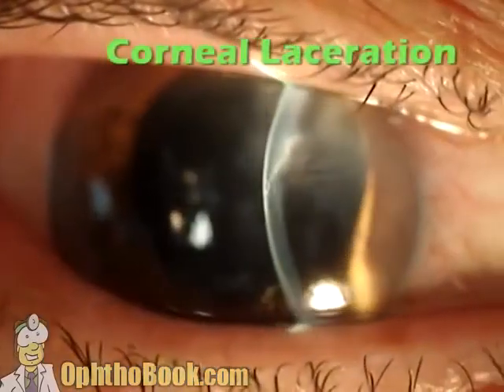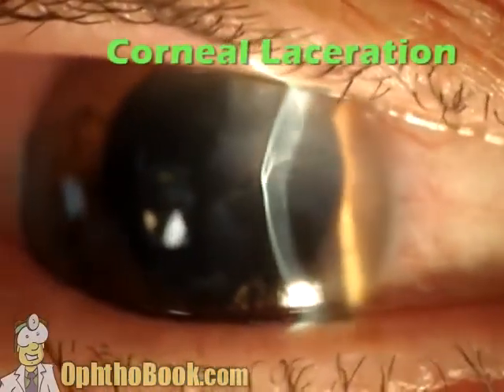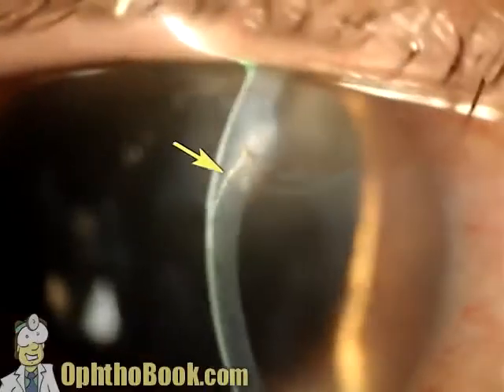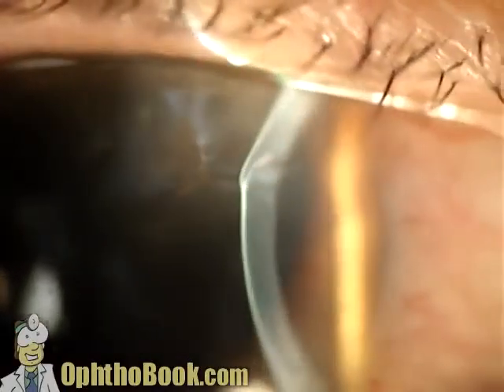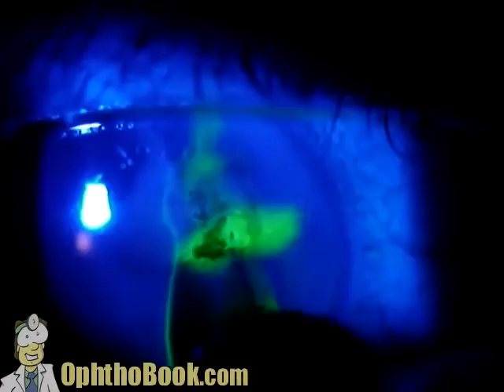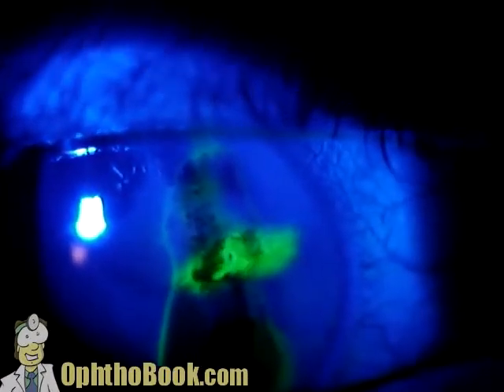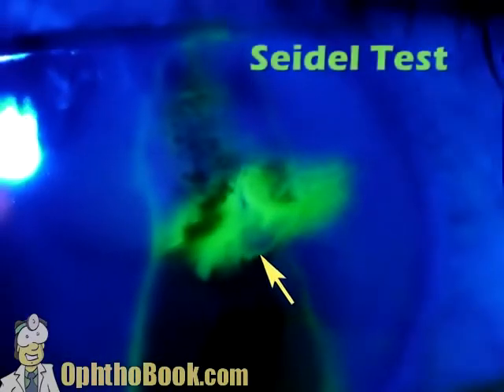This is a patient who has a corneal laceration, a nail through the eye, and we know it's a laceration because if you look at that, you can see a line going from the front of the cornea to the back. The question is, is it leaking or not? It's hard to tell just looking at it. So what do we do? We rub some fluorescein on the surface, and you look for leaks, and this is a fluorescein strip, and you can see that leak right there where the fluorescein is being diluted, and it's very obvious.